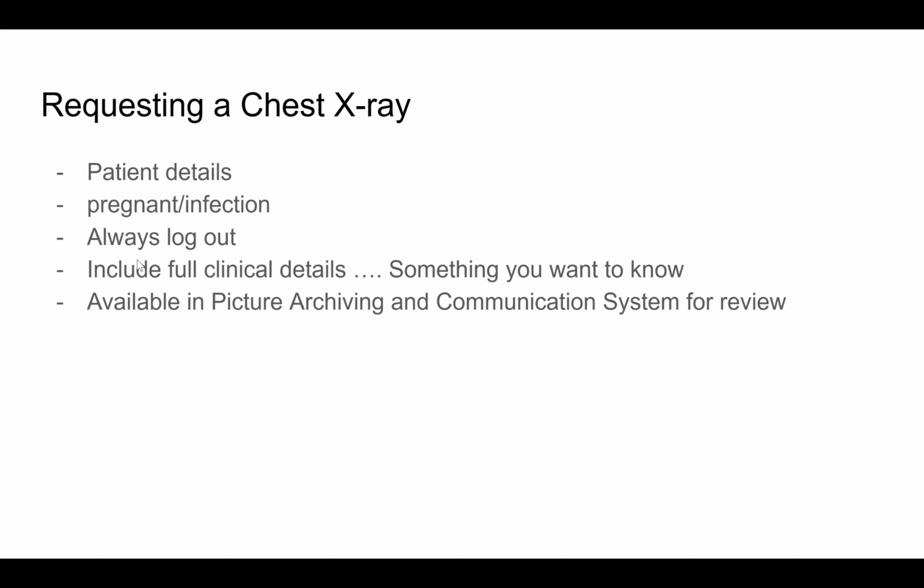We should always include full clinical details because most radiologists see a lot of patients and they don't remember that patient. Most radiologists don't even get to see that patient. So make sure that you give full clinical details, especially anything that you want to know. If you're requesting a chest x-ray, there is definitely something that you want to rule out or rule in, or symptoms that you think point to a disease but you're not sure about it. So you must always state what you want to know from this imaging.